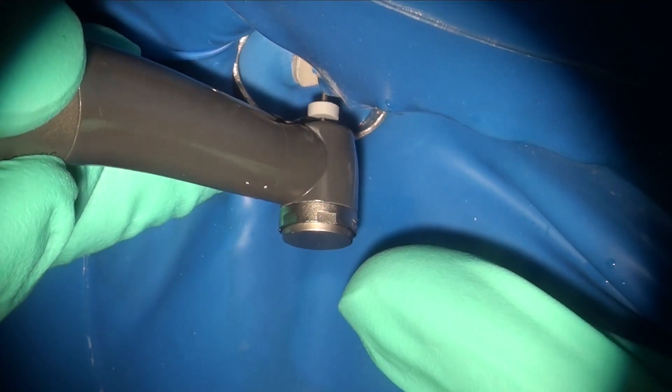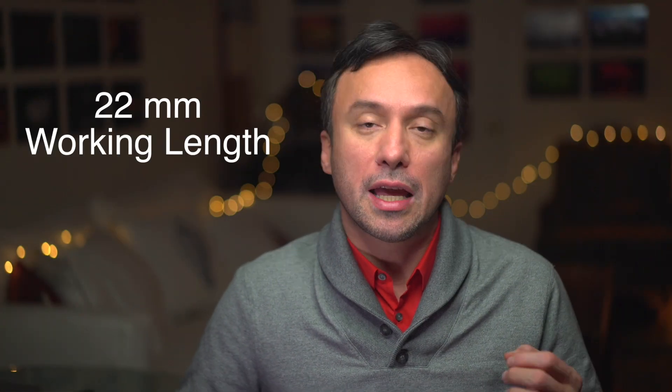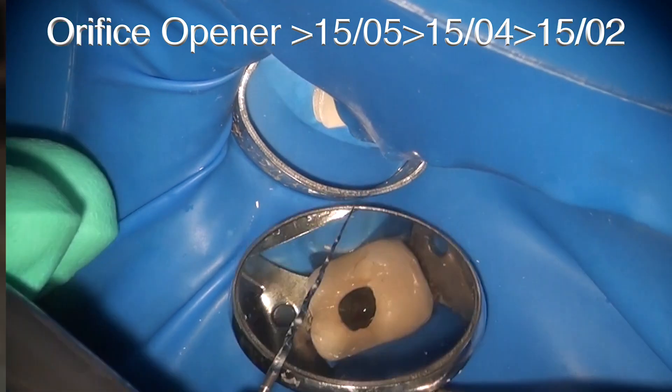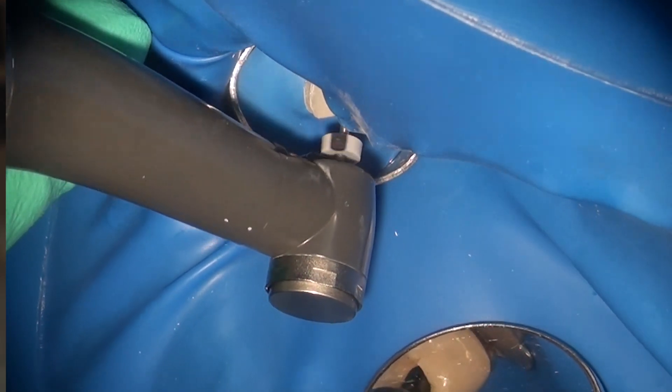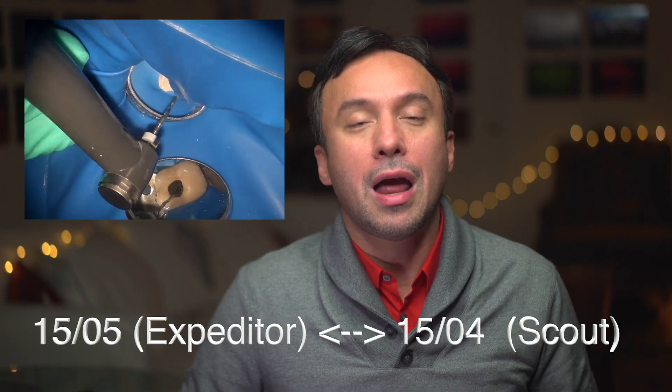As the file achieved length it came to a full stop because of the apical stop setting on the endosync, and working length was measured after the apex was reached — it ended up being 22 millimeters in all canals. Once the 15/02 reached the apex, the 15/04 was then taken to the full working length using the same rhythm motion, wiping the file after each set of three strokes, and then the 15/05 was taken to the apex using the rhythm motion as well. This alternating sequence between the 15/04 and 15/05 is the necessary work to get the expediter down to the apex — you need to go back and forth between the 15/05 and 15/04 after the 15/02 has reached the apex until the 15/05 is at the apex.